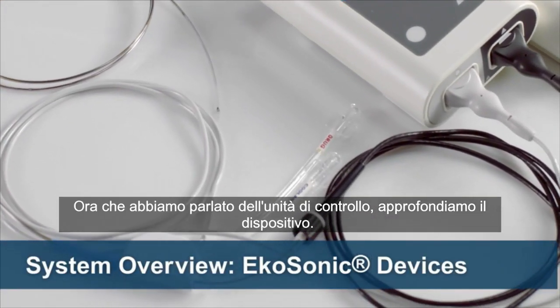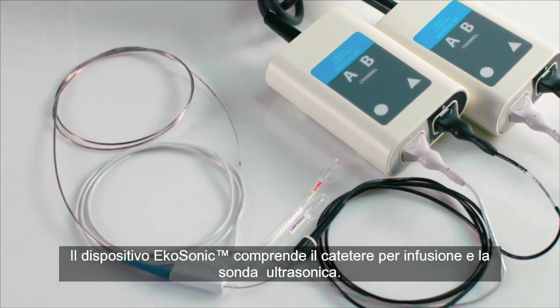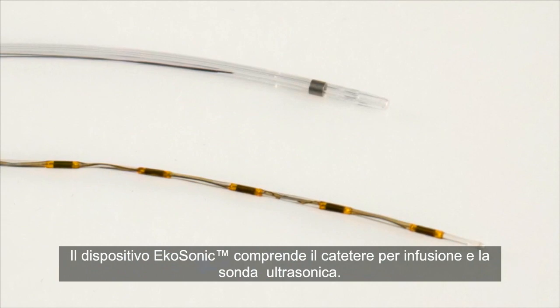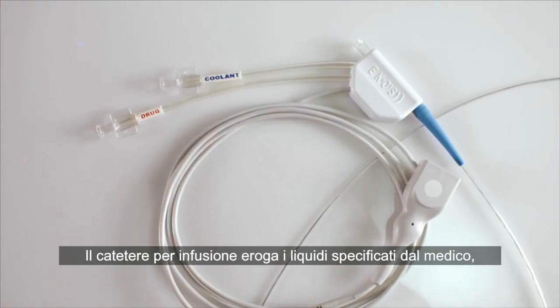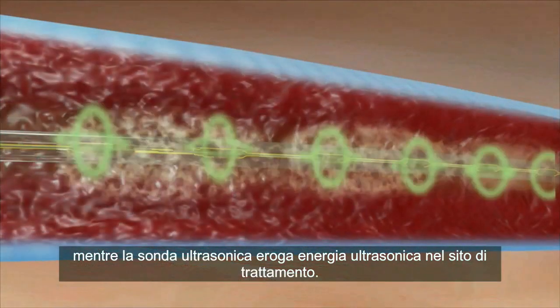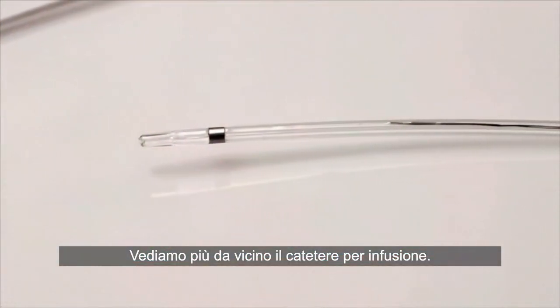Now that we've covered the control unit, let's learn more about the device. The EKOSonic device consists of the infusion catheter and the ultrasonic core. The infusion catheter delivers physician-specified fluids, while the ultrasonic core simultaneously delivers ultrasound energy to the treatment site. Let's take a closer look at the infusion catheter.